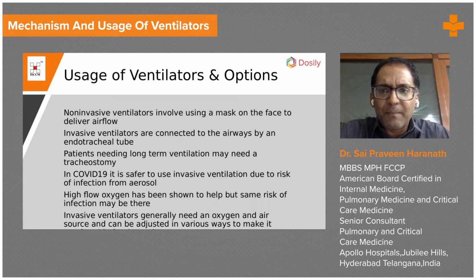Now, there are non-invasive ventilators using a face mask, and they help you deliver oxygen. However, in COVID-19, most of the time, they are recommending not to use it. They are recommending invasive ventilation. There are situations where you have to consider using non-invasive ventilation. You also need to know that an invasive ventilator is connected to an endotracheal tube. That is a whole separate area where the size of the endotracheal tube matters.